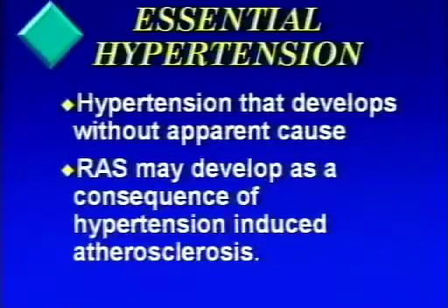Now, when we look at the total population of patients who actually have renal vascular hypertension, only about 5% of the hypertensive population actually has renal vascular hypertension. So you may be wondering, why are we going through all the trouble of performing a non-invasive examination that takes anywhere between an hour and 2 hours to perform when only 5% of the patients are going to be diagnosed with this condition? And the primary reason that we're doing the examination is, number one, it is non-invasive, and it can determine whether the patient has a renal artery stenosis without having to put them through an angiography.